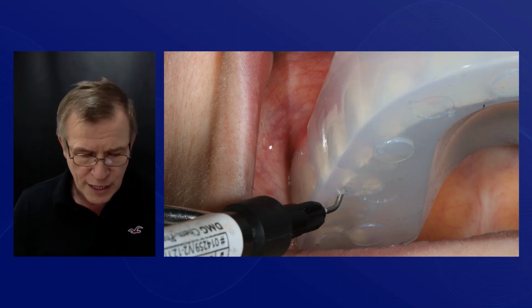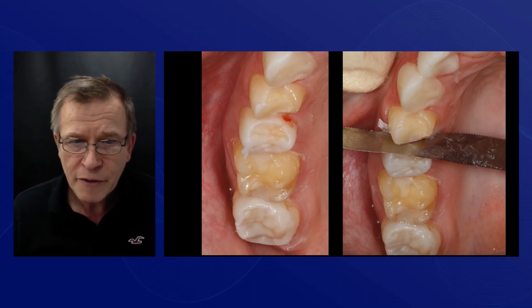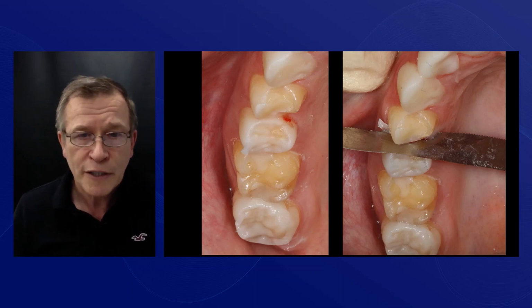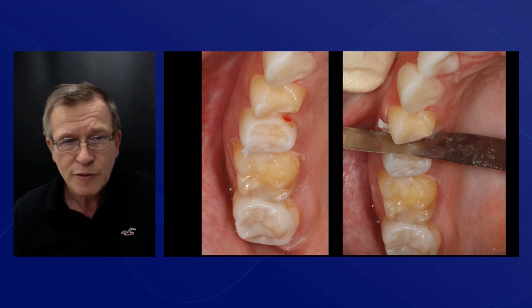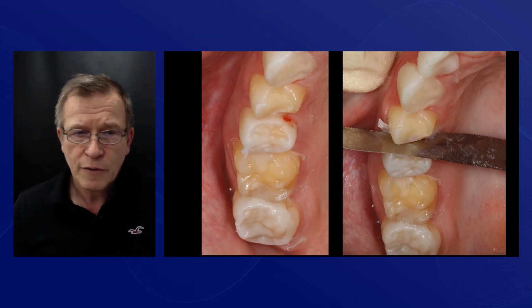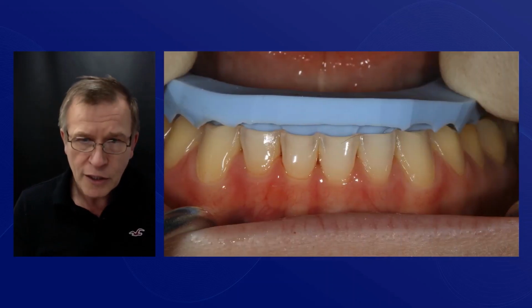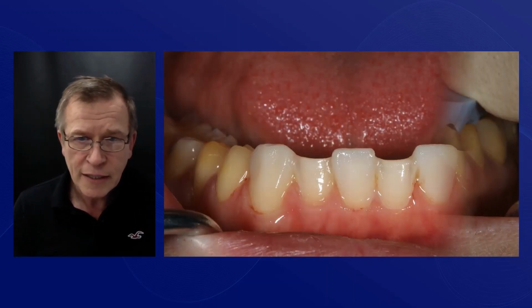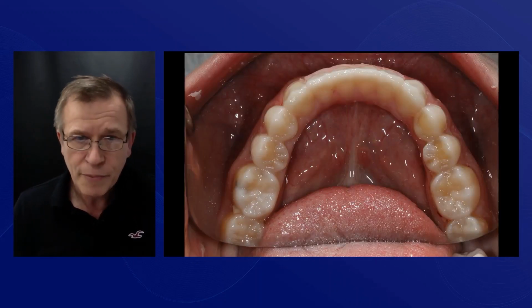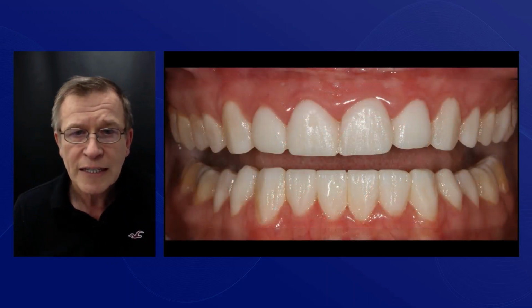So I use this every other tooth now to do some injectable molding on the teeth. So we're doing every other tooth, and you can see, I know all you good people could create this sort of morphology freehand and very quickly. This would take me forever, if at all. But using the digital wax up, we could place the temporaries. We could do the same thing in the whole mouth. You can see here's the lowers, here's the every other tooth, and then this is the whole arches in place. But everything is individualized. Everything is easily cleanable.